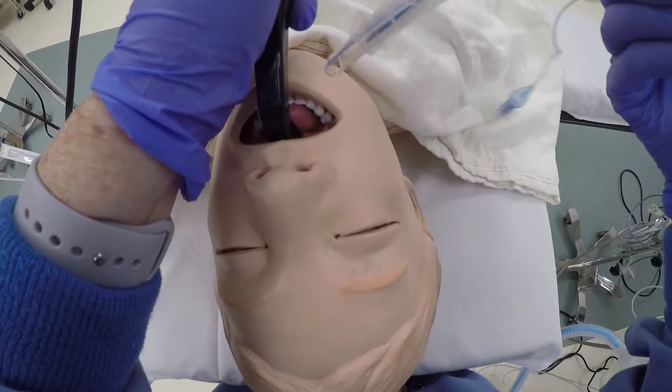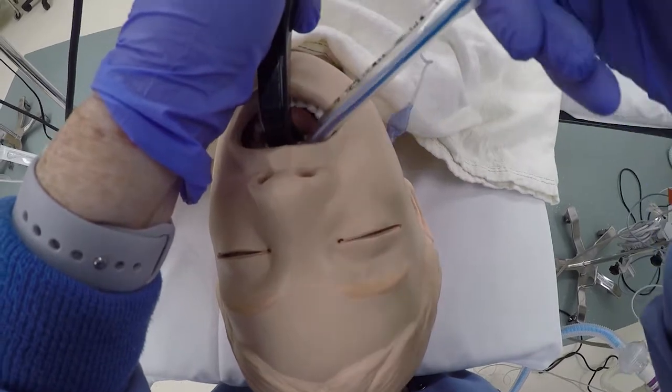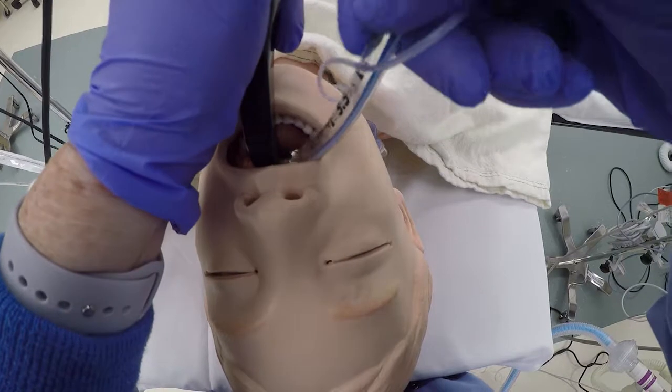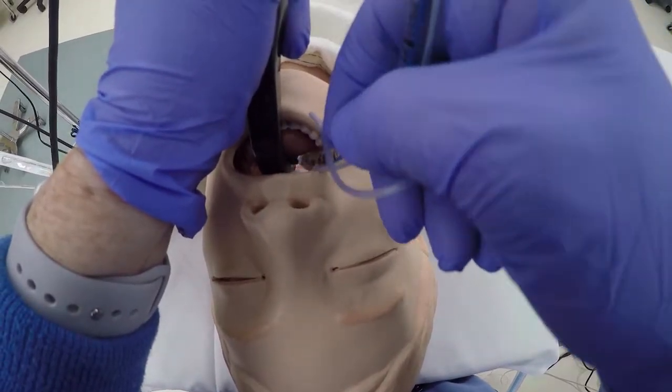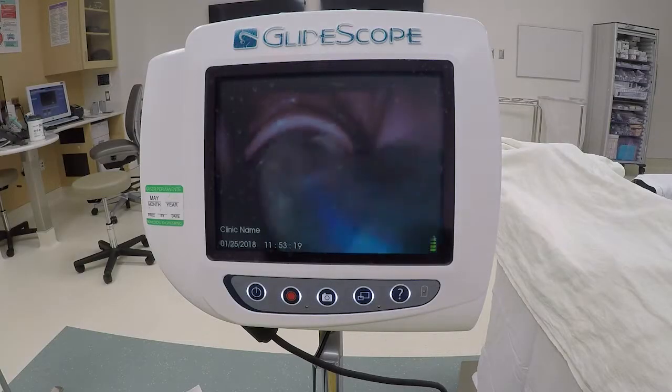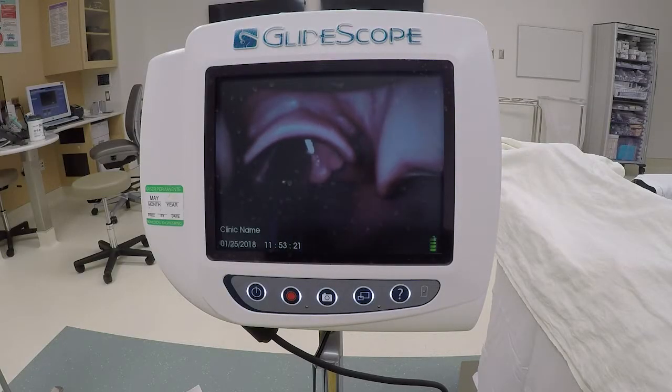Insert the endotracheal tube parallel to the blade, looking at the patient. Starting with the tube rotated 90 degrees to the right and then turning it during insertion can help with tube insertion. Once the tube turns the corner, look at the monitor to guide insertion.